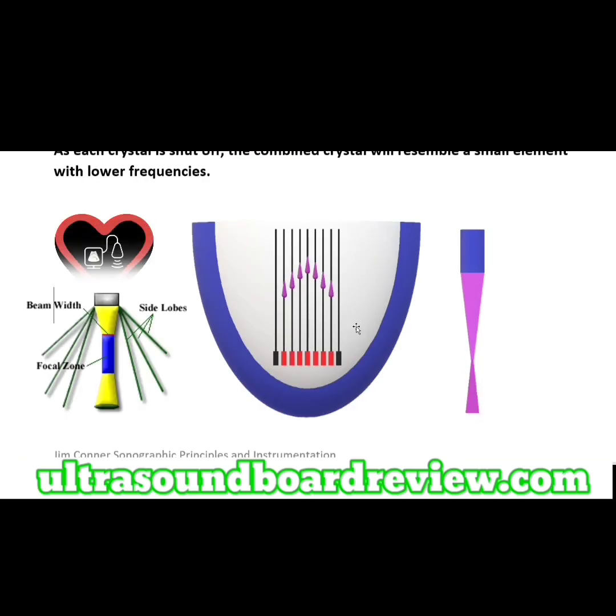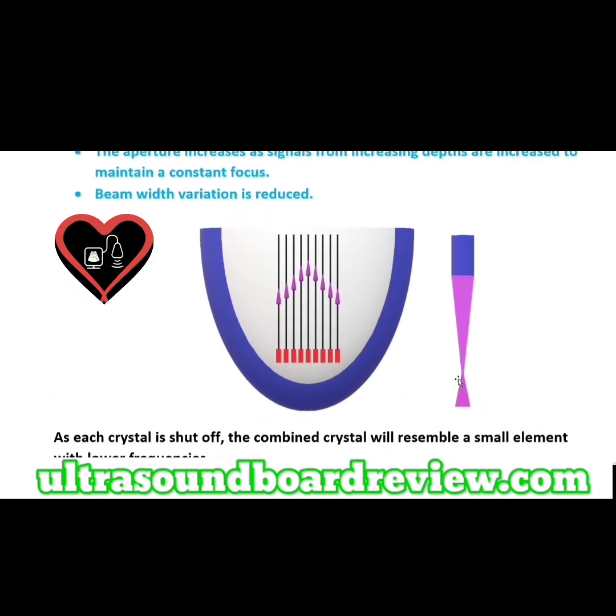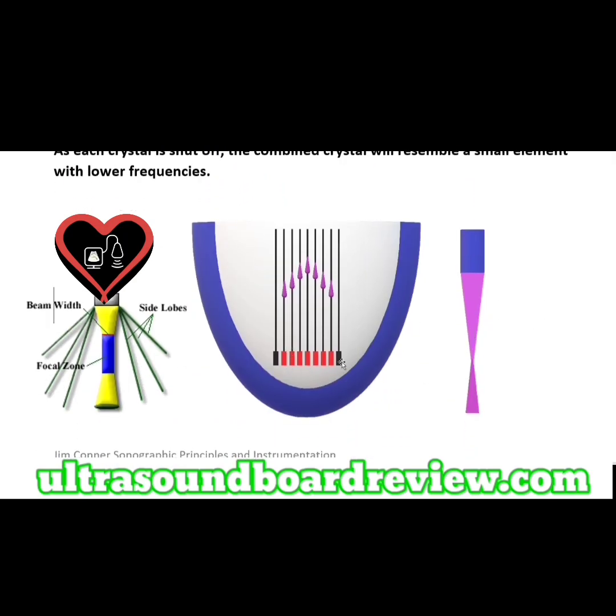If we shut off the outside crystals, that means the size of our crystal gets smaller. And as a result, our focal depth decreases. So here we have a large crystal, essentially, and our focus is penetrated more deeper in the tissue. Here we shut out the crystals, so we're using a smaller crystal, which means our frequency decreased, essentially, and our focal depth decreased, meaning our focus has moved closer to the transducer.